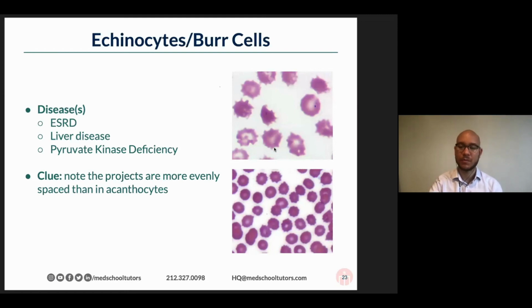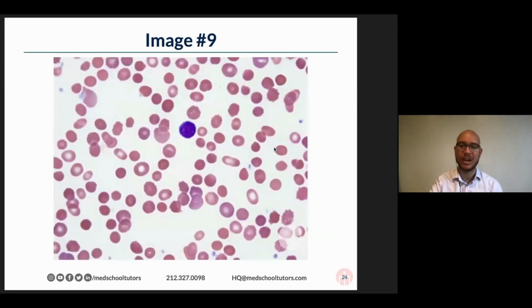Awesome. All right. Here we have another blood smear. While you all are thinking, I'll plug the website that I mentioned again. That's the American Society of Hematology Image Bank. You put that in Google, you'll find a range of examples of each of these diseases. And folks in the chat are already popping off in terms of answers to what this might be.